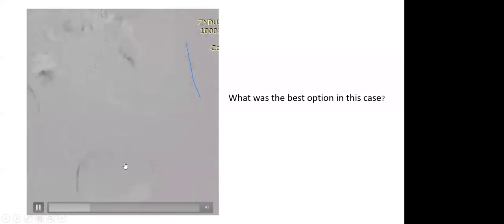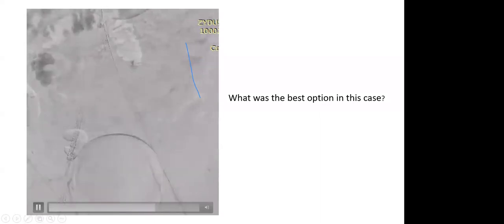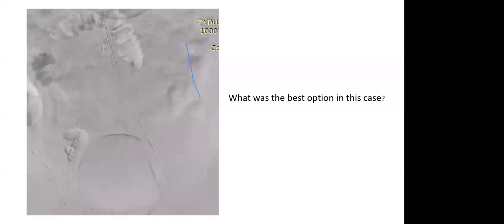Another question, sir: in the aorta, do you do Y stenting or only kissing stenting? For extension into the aorta, you are asking? Yes. So if the aorta is larger than 14 mm, simultaneous deployment from above to below. You have put bare metal here, no? Yes, bare metal only.